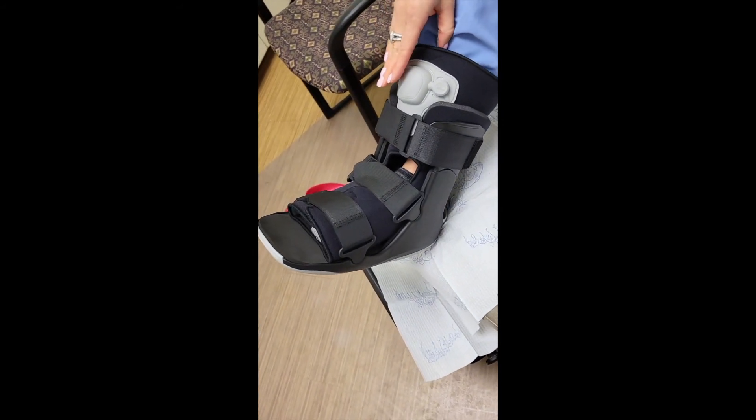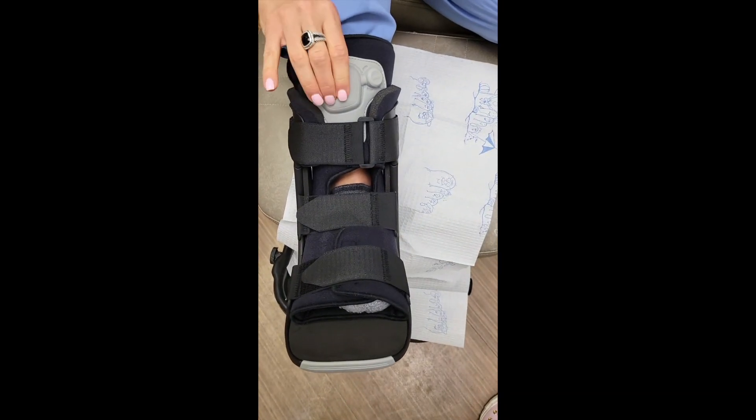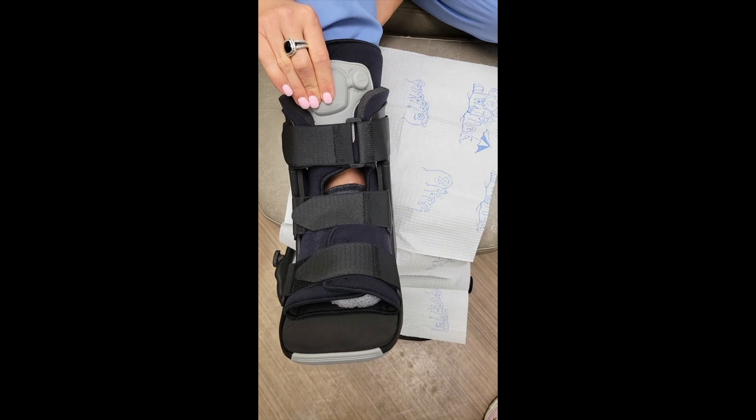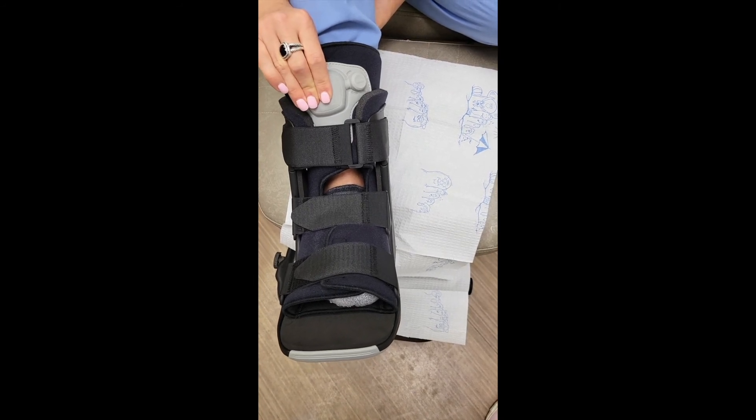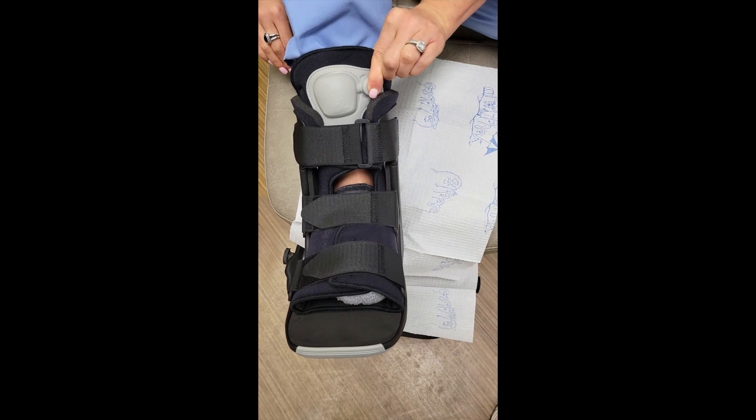If it is feeling a little loose, you push on this portion of the boot and it will fill the compartments with air making it a little tighter. If you've made it too tight, just press this little button and it will release.